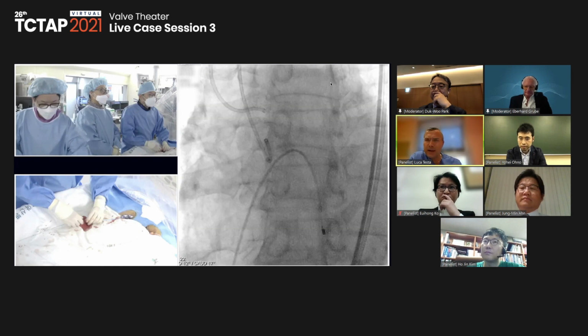To be honest, we tried with the MRI, we tried with the CT scan without contrast, we tried several ways. However, at the end of the day, when you have a very good and expert echo guy, that'll be very reliable. I'm not saying 100% because, of course, there is always a margin of error. However, it is reliable, but it depends on the experience you have.